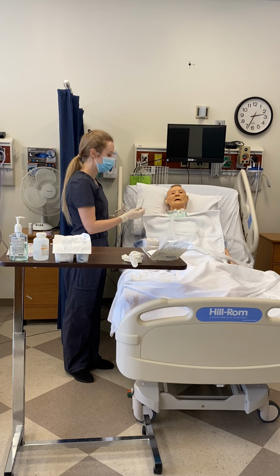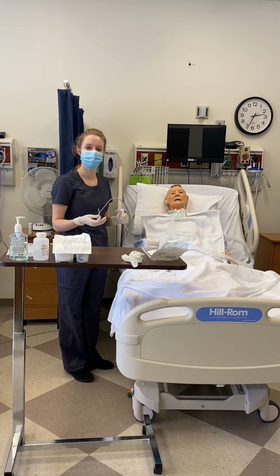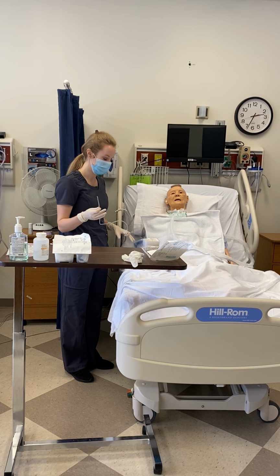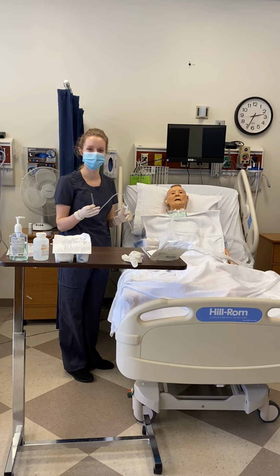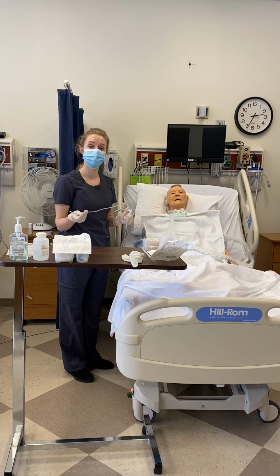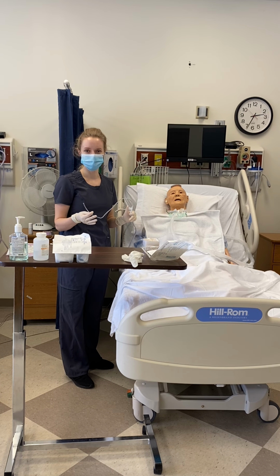Giving Mr. Smith some time to rest here, oxygenating him, encouraging him to cough and deep breathe if needed. May want to, at this point, check his pulse, respirations, just to ensure he's still doing well. I do as many passes as needed, but I don't want to go for more than about 5 minutes.